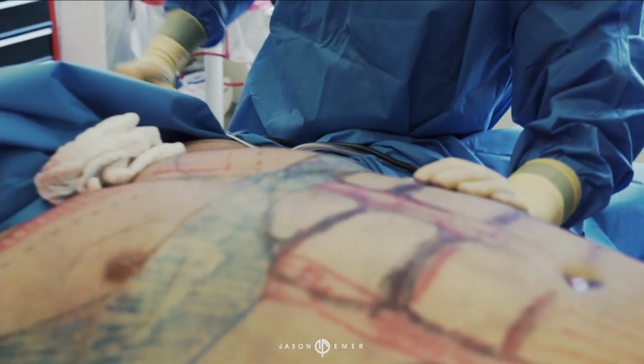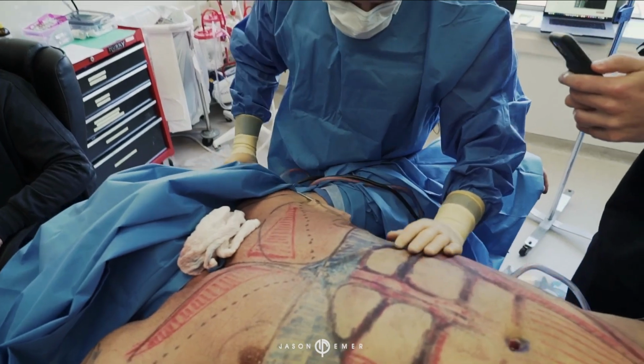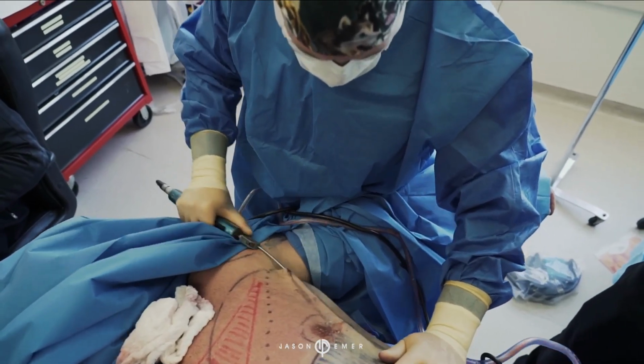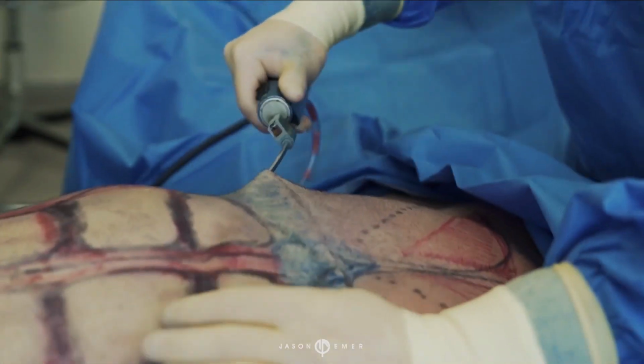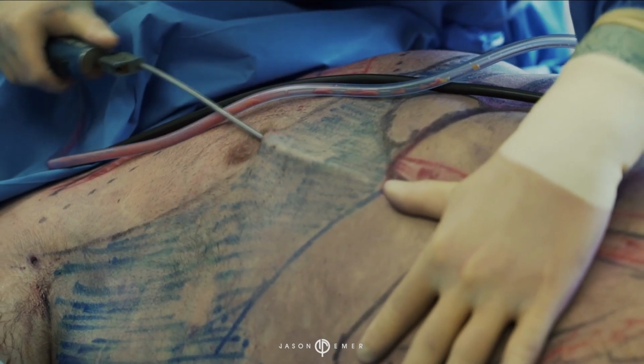So now we're sculpting the chest, especially the borders of the chest. And you guys can see we're literally right on the bone, so you have to be really careful. I mean, you can see the cannula. He doesn't have much fat. Now we're sculpting out the abs. And again, remember, he doesn't have a lot of fat, so we really have to be careful about where we take it.